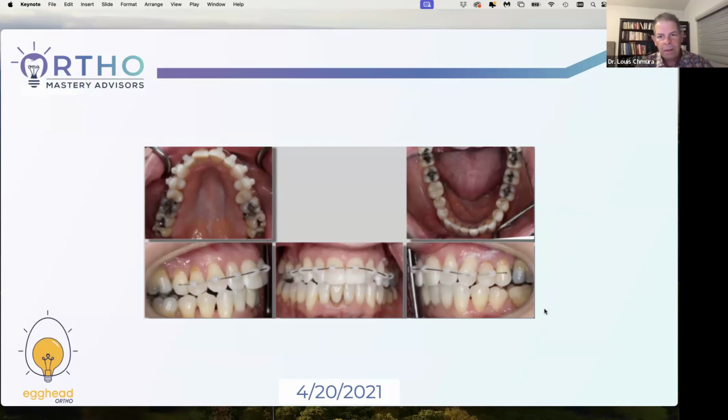the smile arc. In this case, I've got a limited, I mean, this looks a whole lot better than her smile as far as the cant of the occlusal plane. That's why you need facial photos too, okay? And in retrospect, I should have gone back to the second bicuspid on the top, but I didn't. So we had to fix those in the aligners.